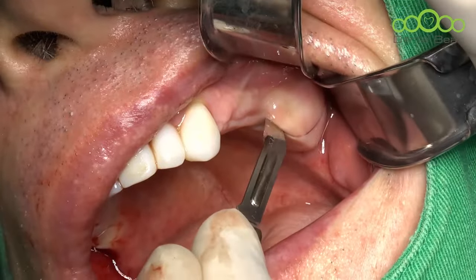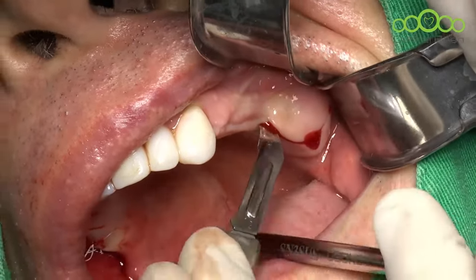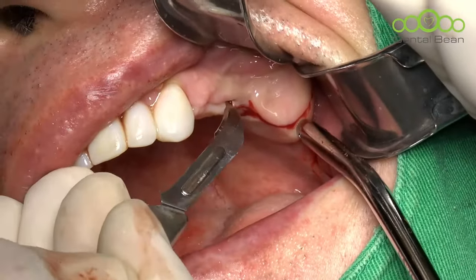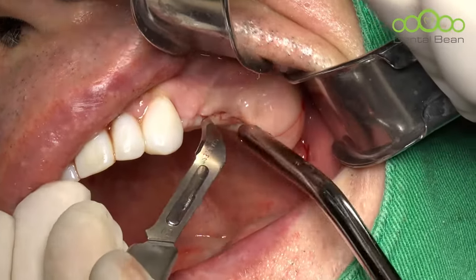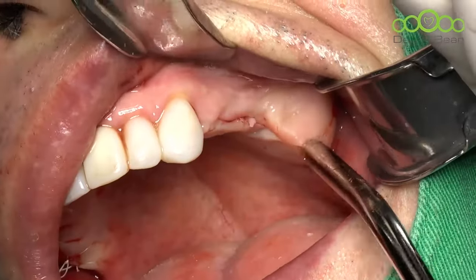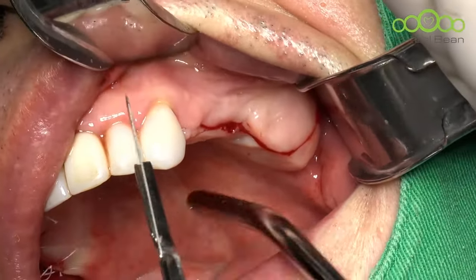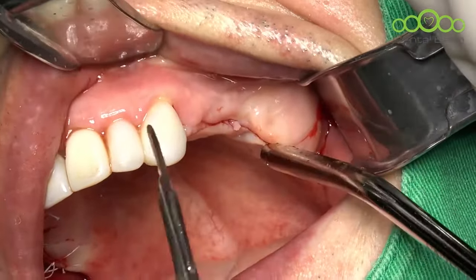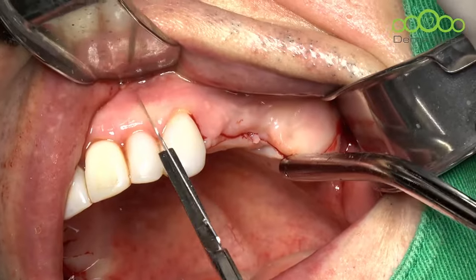It's very thick soft tissue. Okay. It's irregular bone. Okay. And anterior vertical here. I like to make the incision here. This is the line angle. Some dentists like to make the incision here. I prefer here.